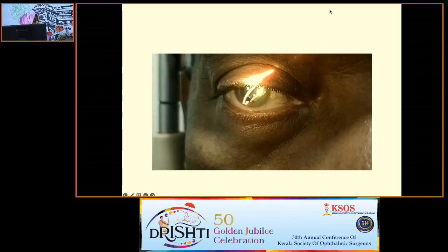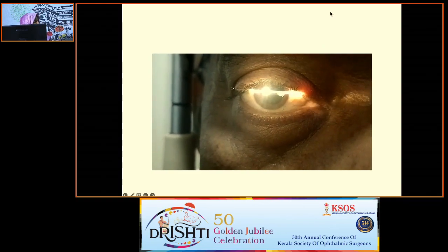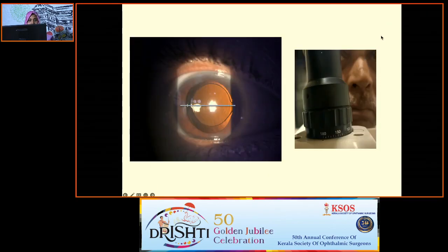You can turn the slit lamp to a thin slit beam of light to align the IOL marking. So, the patient's IOL is aligned at 180 degrees.